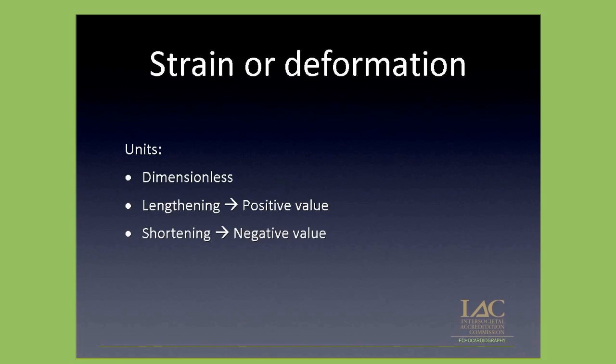It is very important that you understand, and this can cause confusion, that you are going to have positive and negative values for a strain. So in the long axis of the heart, as you have seen in your echo machines, the long axis will get smaller when the heart contracts. Therefore, by convention, the global longitudinal strain will always be negative, and we will talk about normal values in a minute. And then the radial strain: you have seen that the thickness of the muscle increases during contraction. So that, by convention, will always be positive.